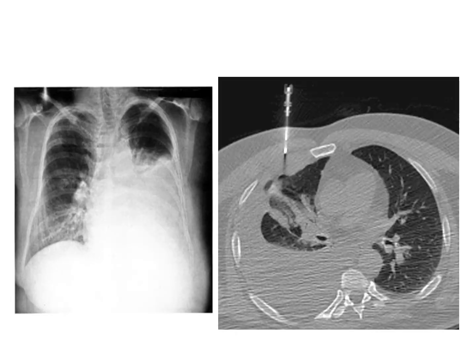This is just showing you the difference of looking at the same patient. Looks like they may have a mass or something going on here. So we have the chest x-ray on the left, and then on the right they could be doing a thoracentesis, or a needle biopsy here, where you can see a syringe being inserted, so they can have a better idea exactly where they're going under the CT view.